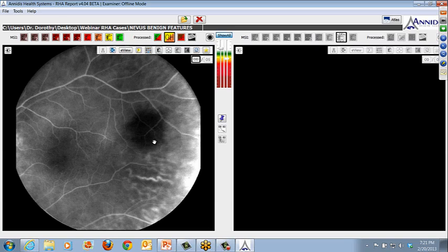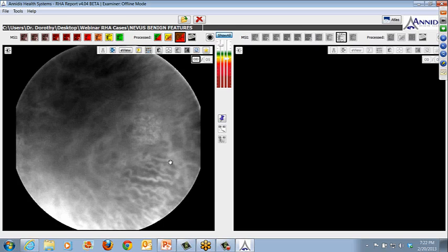On the oxy map here, if there's a break in the RPE, okay, a break in Bruch's or a general break in the RPE, that could be an indication that the lesion is elevated, has changed, has grown, and it certainly broke through the upper layers of the retina through Bruch's, and you will see some patchy areas here. Okay, this is still nice and even, and the color is even. And on the choroidal map, again, highly regular lesion. And in the choroidal map, you want to watch very carefully the edges here to see if there are vessels that are specifically feeding that lesion and in any pattern. And I really don't see any pattern here.